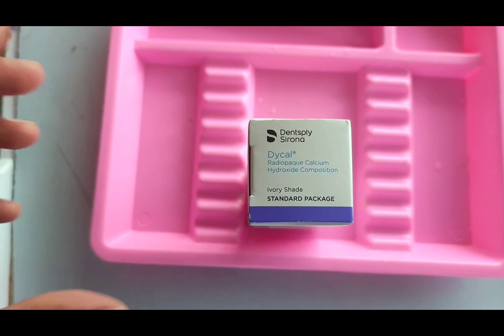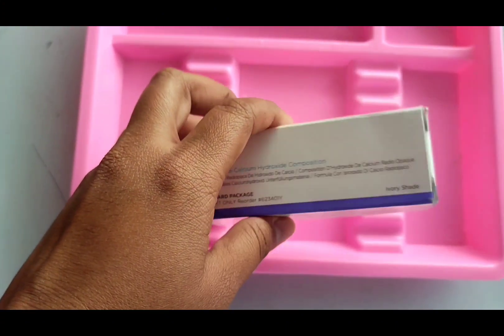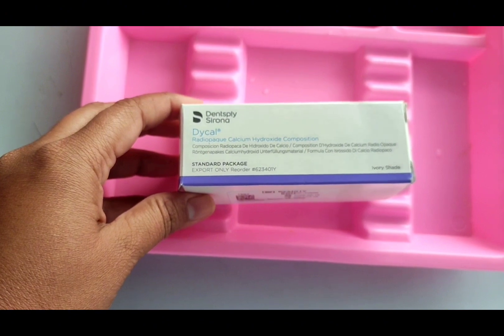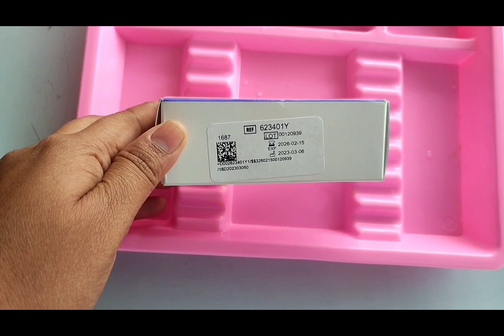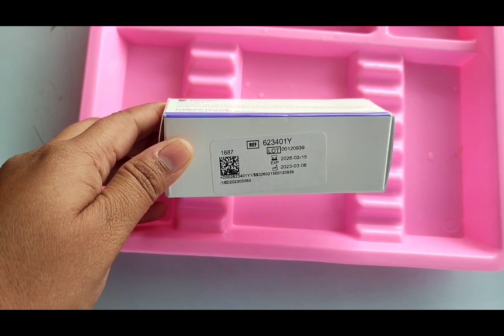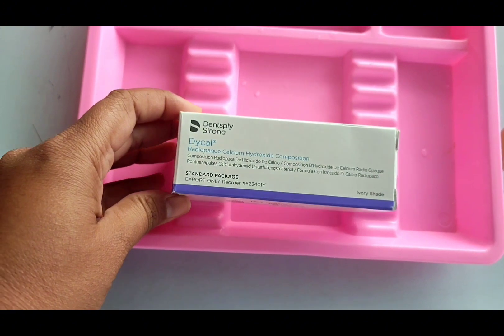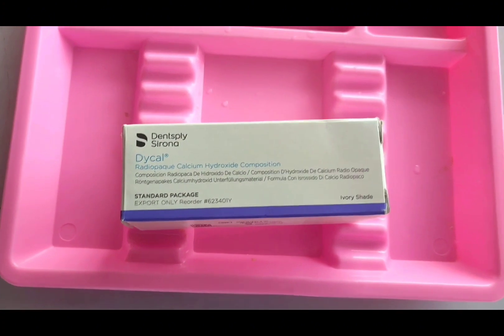Today we are going to talk about Dycal, which is a radiopaque calcium hydroxide liner from Dentsply Sirona. Dycal is a two-component rigid setting self-curing material designed for use in direct and indirect pulp capping and as a protective liner under dental adhesives, varnishes, filling materials, cements, and other base materials. It will not inhibit the polymerization of acrylic and composite restorations.